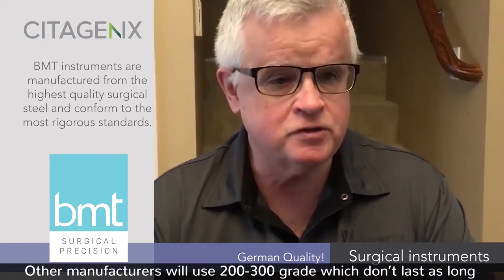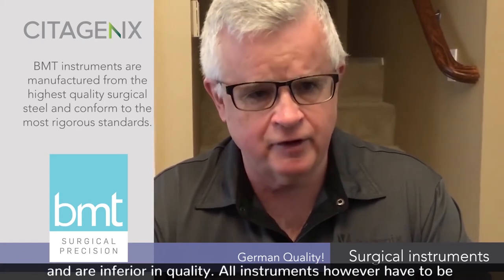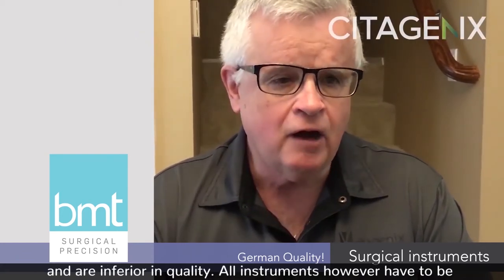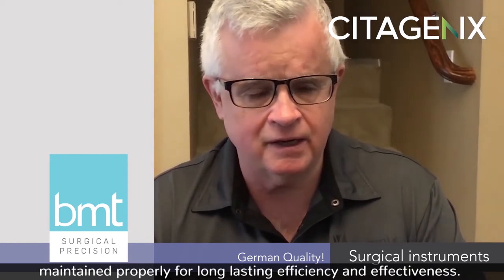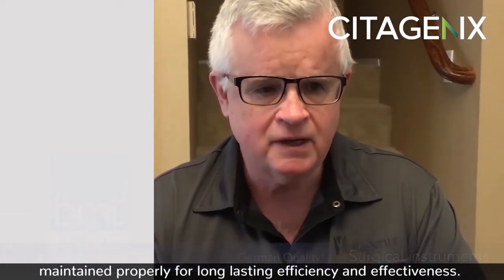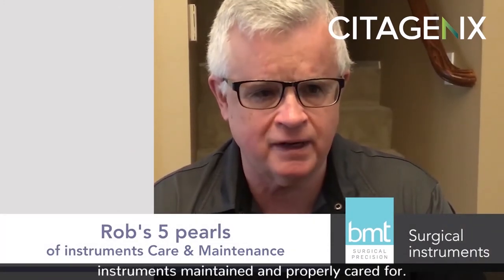Other manufacturers will use 200 and 300 grade, which don't last as long and are inferior in quality. All instruments, however, have to be maintained properly for long-lasting efficiency and effectiveness. Following are my five pearls for keeping your instruments maintained and properly cared for.